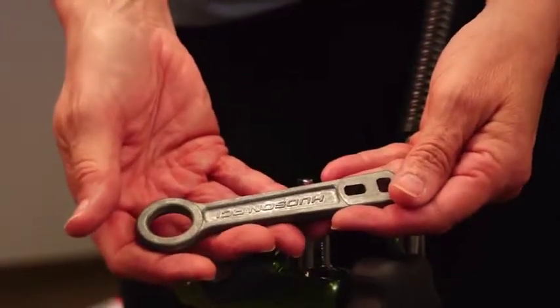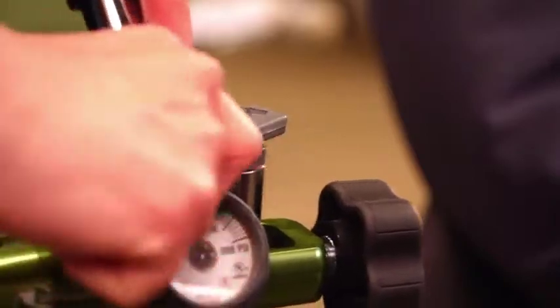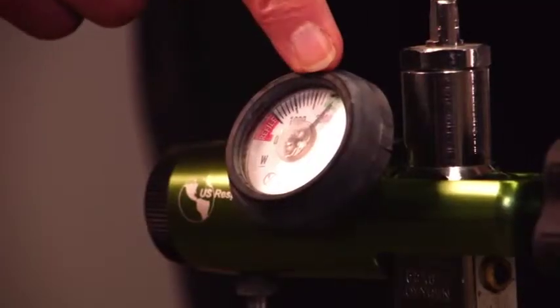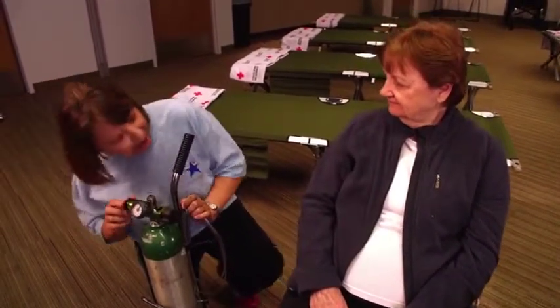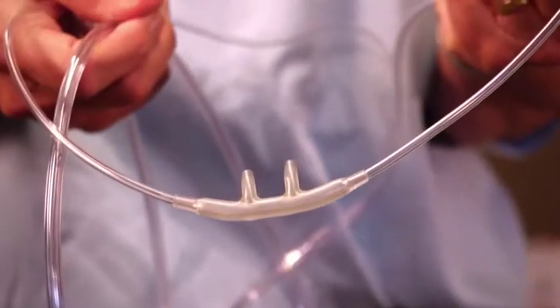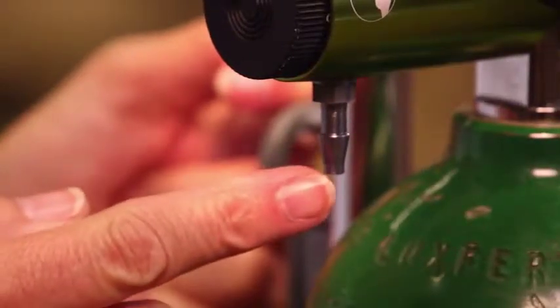To open the tank, attach the key to the top of the tank and turn counterclockwise. The needle on the gauge should indicate that the tank is full. Check for leaks — you will be able to hear them. Attach the tubing for the nasal cannula to the tank at the outlet on the regulator.